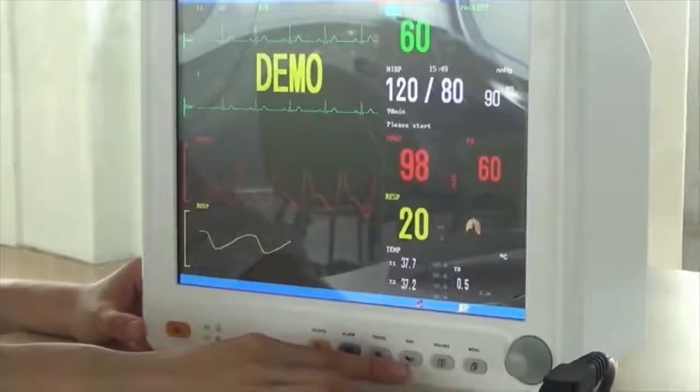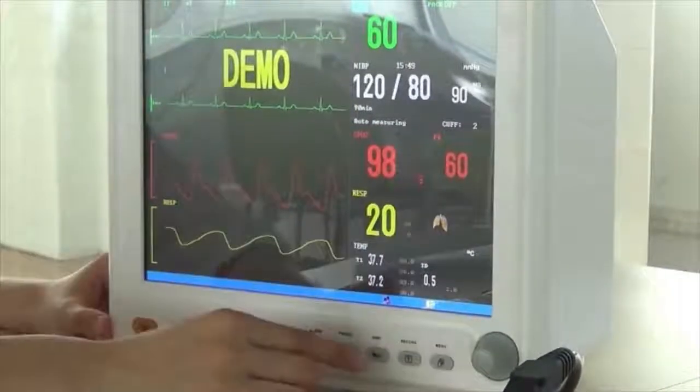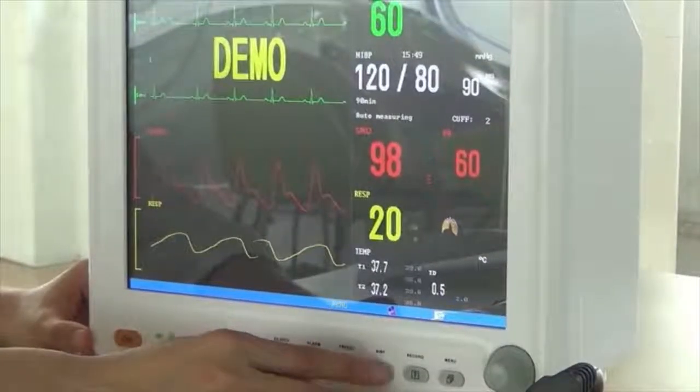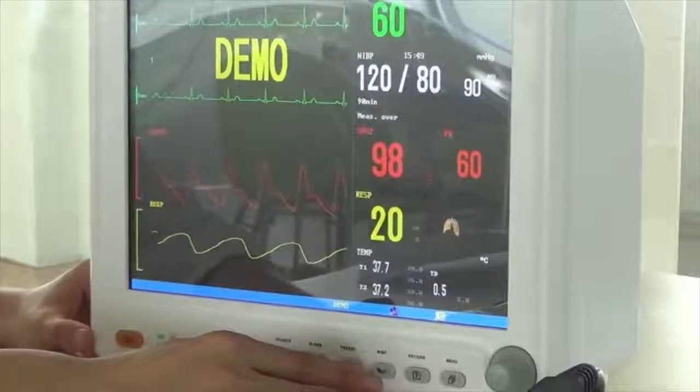N.I.B.P. Press it. You can see the patient monitor has begun to measure and inflate the cuff. Press again, and it will deflate the cuff and stop the measurement.